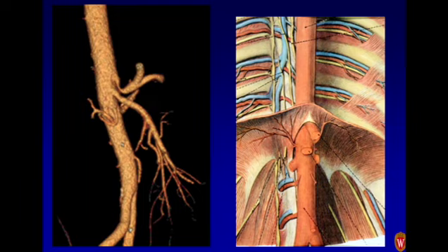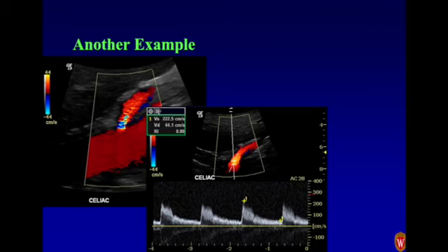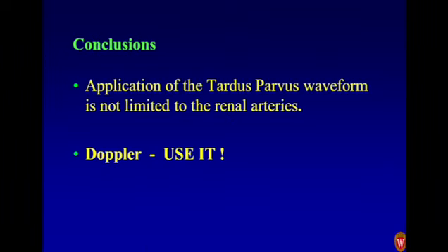And we would have completely walked past it had I not stumbled into it with the ultrasound. Here's another patient, same thing. You can see that jet, and it's kind of fun. You can see a difference between inspiration and expiration as that diaphragm slides across the celiac. It can make it worse. So use your Doppler. You'll be surprised what you could see with it.